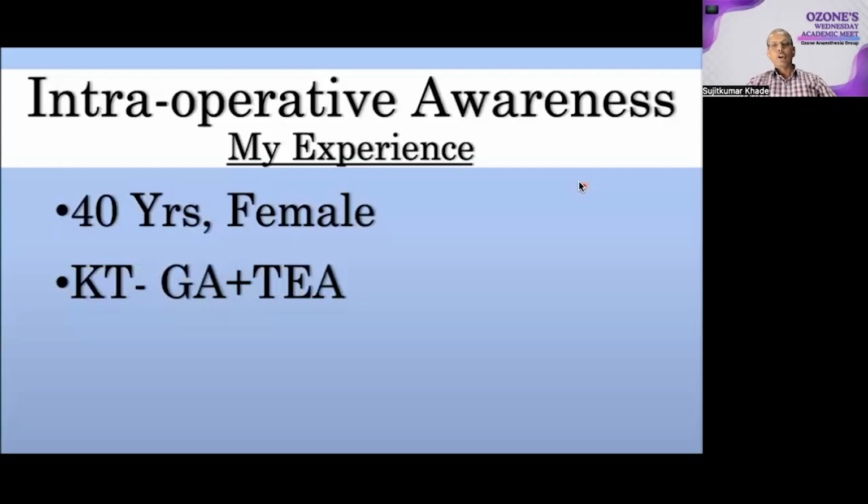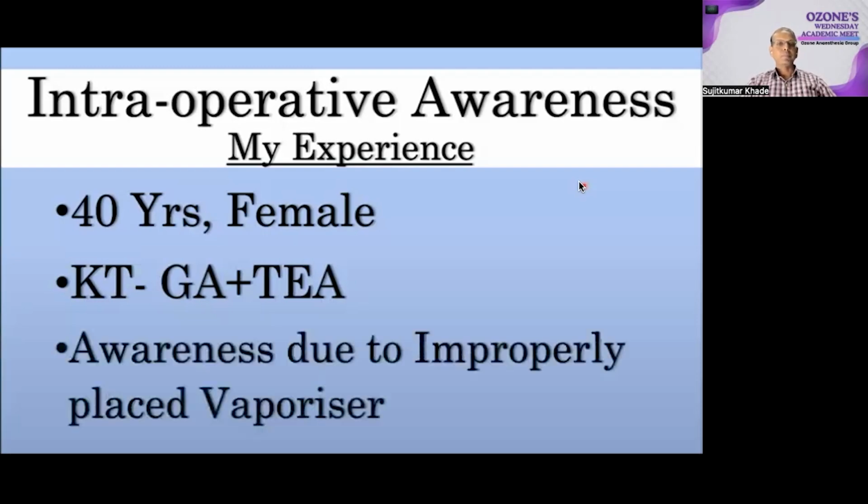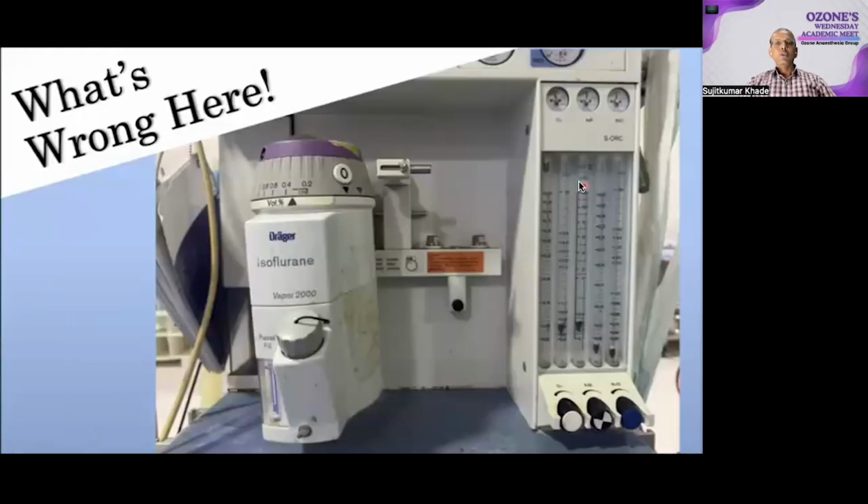Now we looked for causes, and what we found was awareness due to an improperly placed vaporizer. Can you guess what's wrong here? The vaporizer is slightly tilted towards the left. You guessed it right. The isoflurane vaporizer was not fixed properly. It is slightly tilted towards the left, not much.